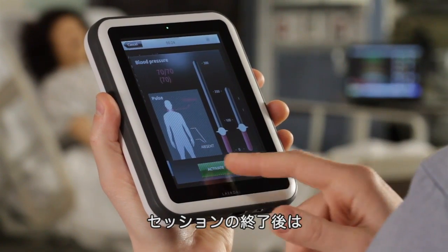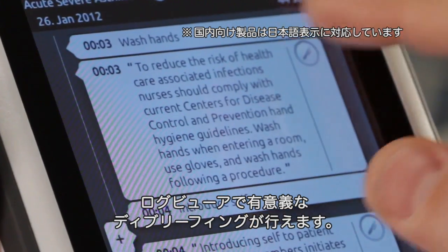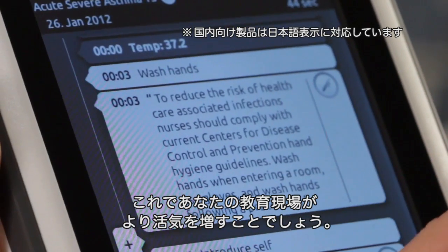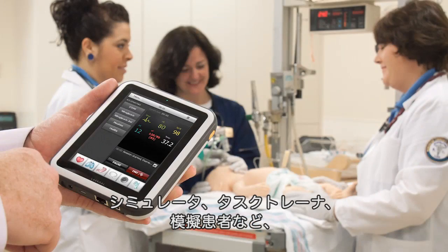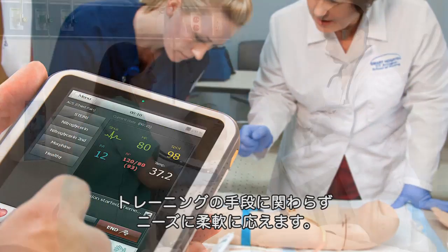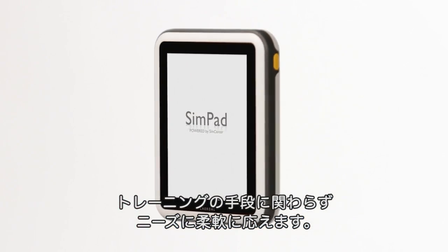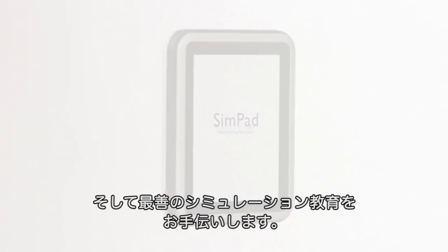After your simulation session, the log viewer application aids in a meaningful debriefing session. Now you'll have the ability to revitalize your current simulation program. Whether you're training on a simulator, task trainer, or standardized patient, SimPad has the flexibility to support your needs and help you provide the best possible simulation experience.